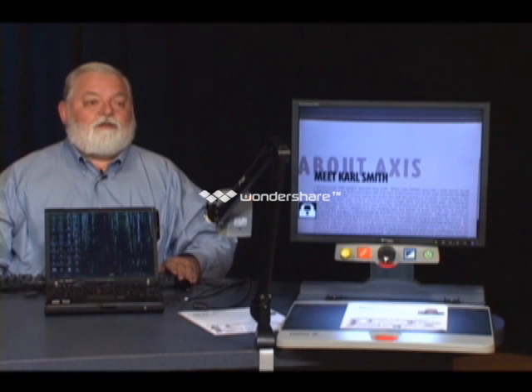The other thing is if you try to write under this, say you put your checkbook under there, which I encourage all of you to do, and write me checks. If you put your hand down there to write the check, some people have a problem with the camera trying to focus on their hand rather than on the check or the contract or the letter they're trying to write. So you would put the page down just like Neil has here, and once it's focused, just turn off the autofocus. Now it's going to stay focused on that single page or that check or that letter that you're writing, and then you can put your pen down there and write all you want to.